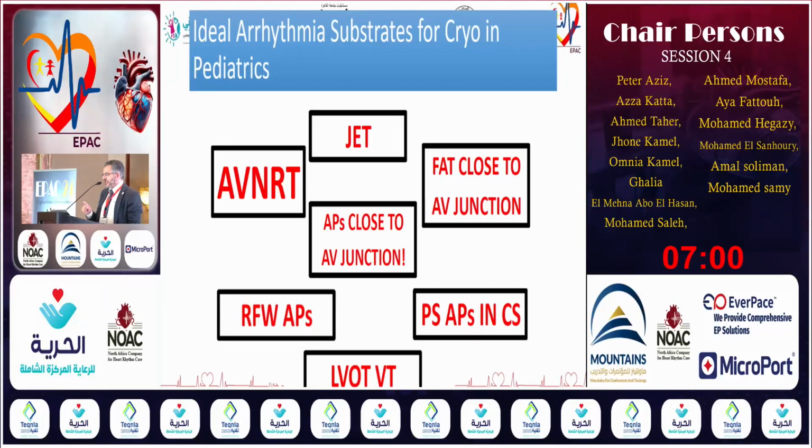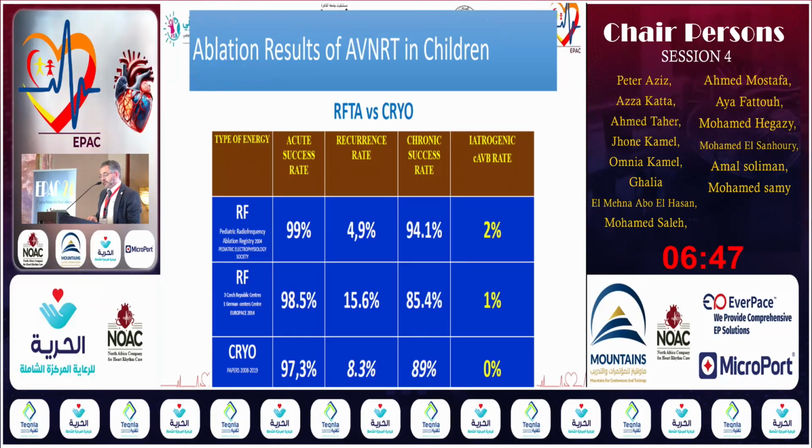The cryoablation gives you the advantage that once reaching the correct location on the right free wall, the catheter sticks to where you want it to stick, and it doesn't move from there. So it's advantageous there. And of course, when you're ablating near the coronaries, like in the LVOT. So what is the evidence we have for that?